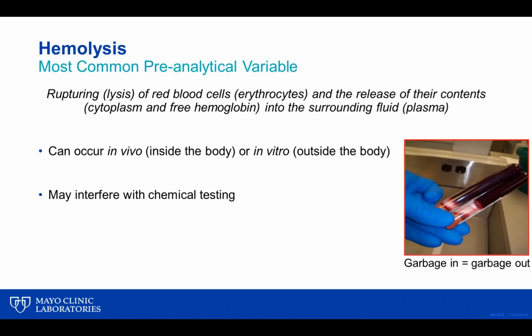Testing. And so we have to be aware of what the problems are and how we address those. I like to show, from a testing perspective, garbage in really does equal garbage out. We want to make sure that we have the best specimen we can collect so that we provide the most accurate results possible.